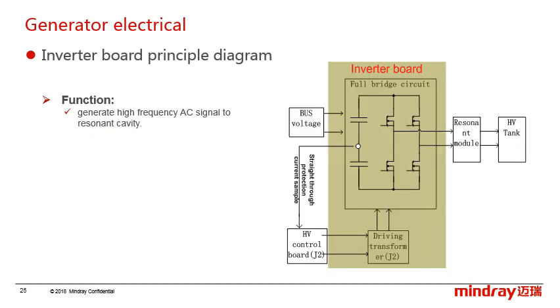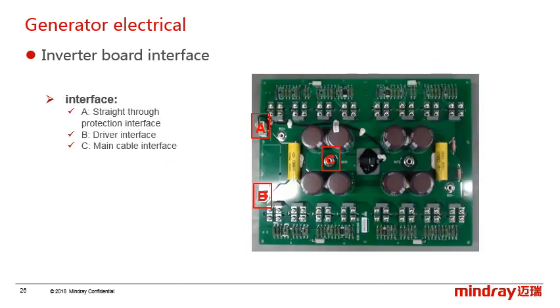For the inverter board, its function is to generate a high frequency AC signal to the resonance cavity. And this is the inverter board picture.